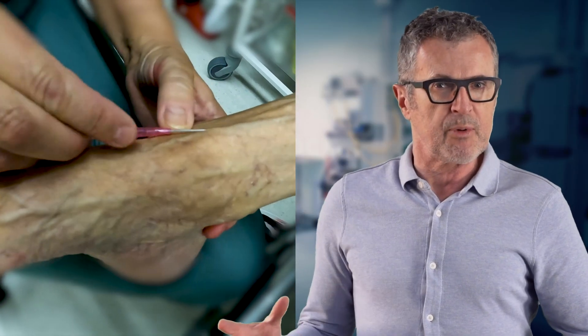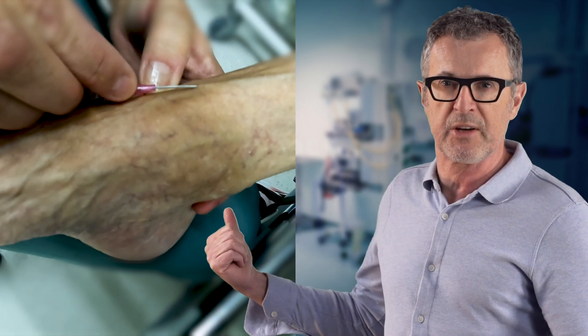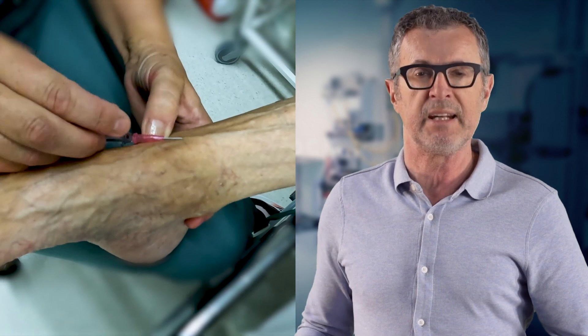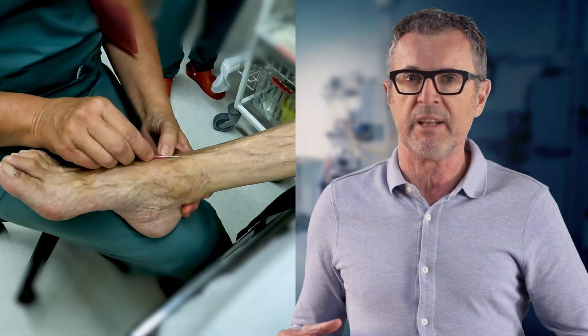And that was it — troubleshooting the IV in the foot. Even though the veins in this patient looked easy, the combination of thick walls and the propensity of the veins to roll made it a lot more difficult than expected on first look.